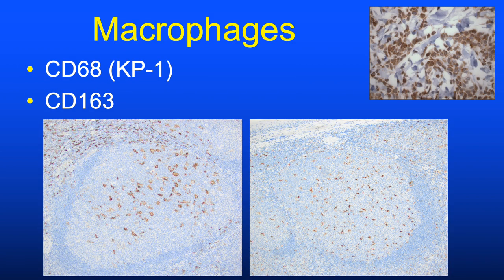Commonly employed macrophage markers include CD68 and CD163, with CD163 regarded as the more specific. In side-by-side stains of lymphoid tissue, the tingible body macrophages in the follicle center are highlighted comparably by both, and distinguishing which is which can be challenging.